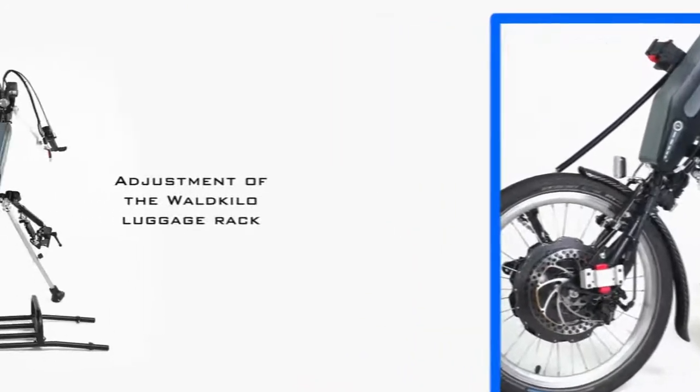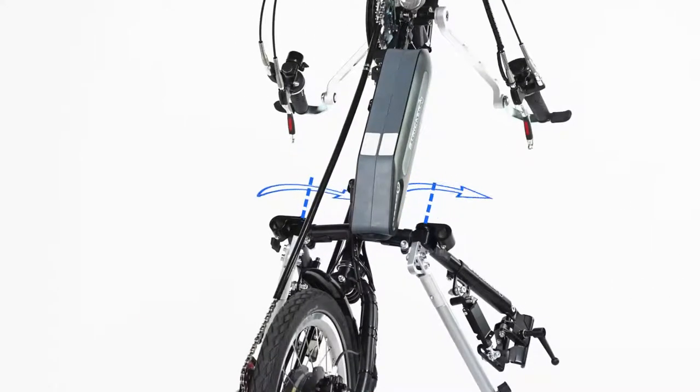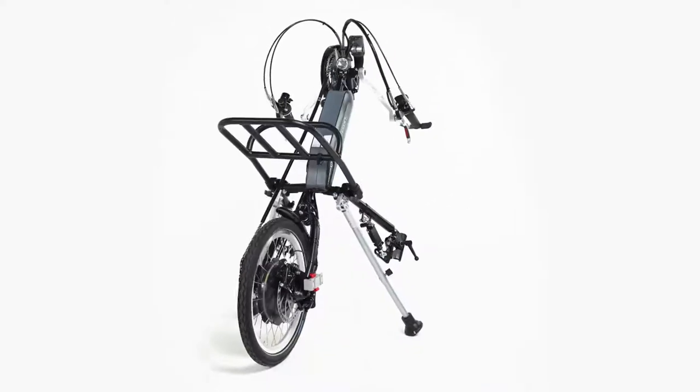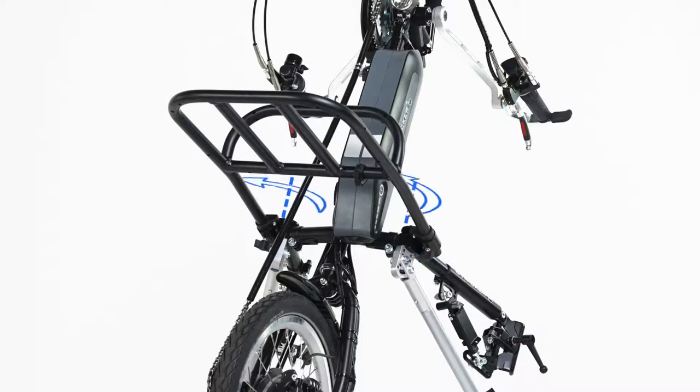To adjust the Stryker bike luggage carrier, open the frame screws on the corner brackets, slide the luggage carrier into the holders and align them, then fix the holders with the frame bolts again.